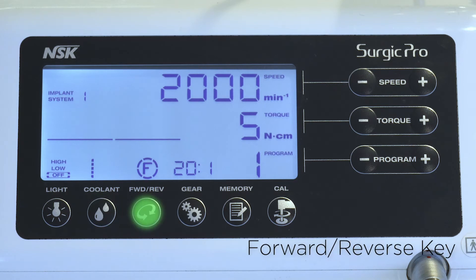Use to select direction of rotation. Press the key once to change the rotation direction. Once in reverse, the control unit audibly warns with a beeping sound.